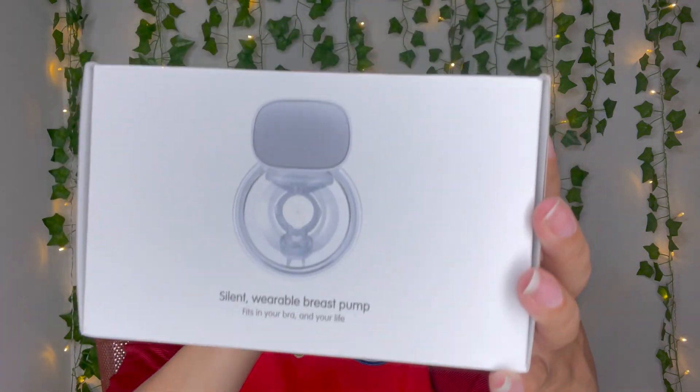I purchased this wearable breast pump. This is the Mom Cozy Wearable Breast Pump — electric, hands-free, portable, breastfeeding, spill-proof, ultra quiet, pain-free breast pump with two modes, five levels, and it's 24 millimeters. It was $59.99 off of Amazon.